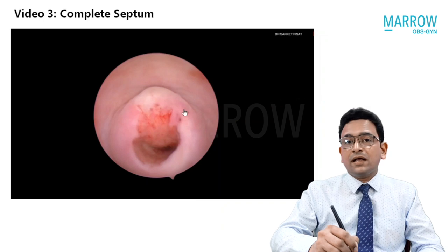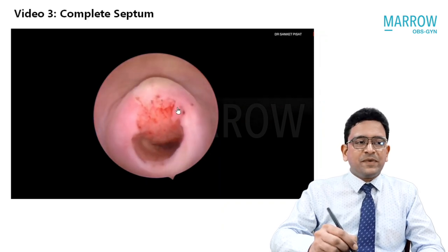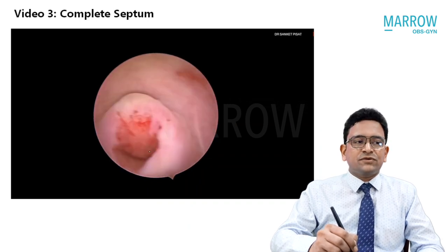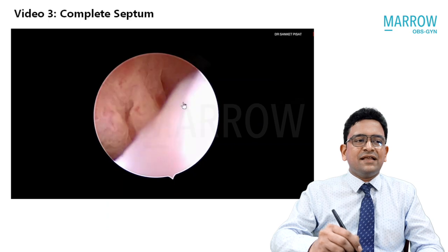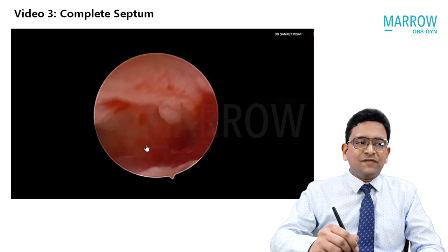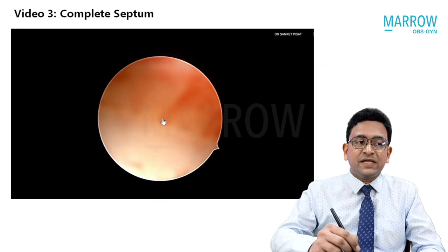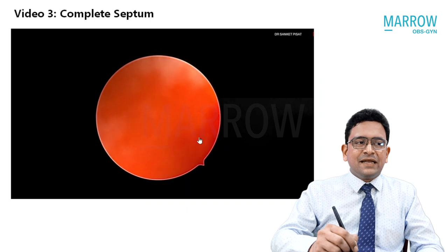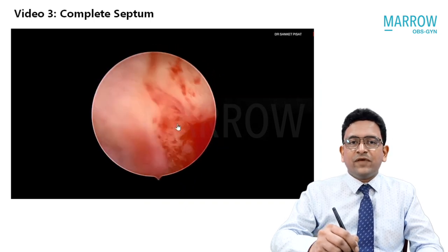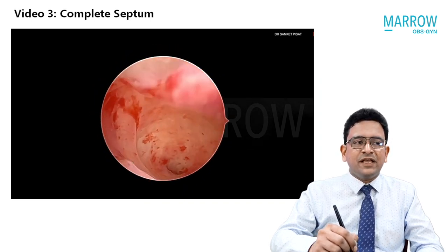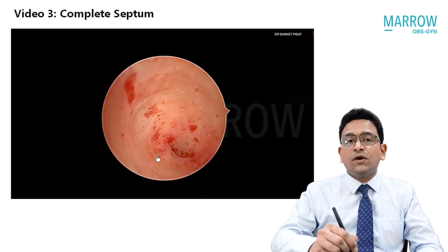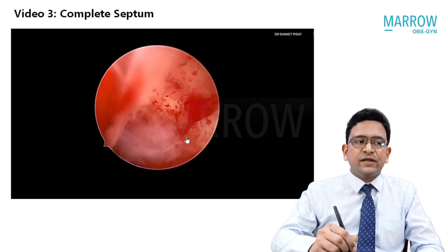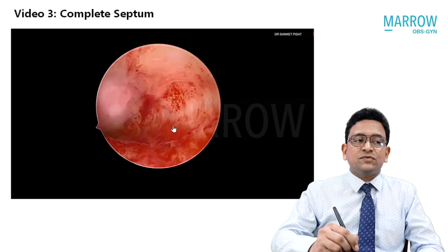Now we move on to a patient who has a complete septum. The cervix is seen clearly and the hysteroscope is gradually entering. There is a single cervix — two cervices are not present, so there is no question of a complete duplication or didelphys uterus. As we go inside the cavity, you find that there is only one ostium seen on one side, even when you turn the telescope 360 degrees.